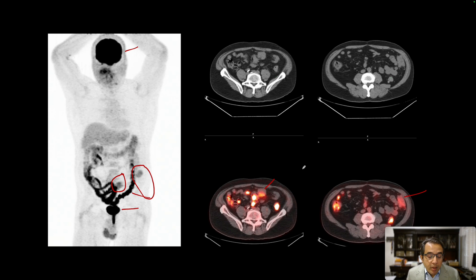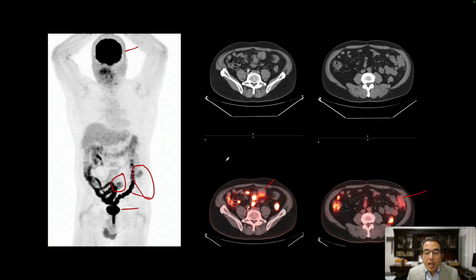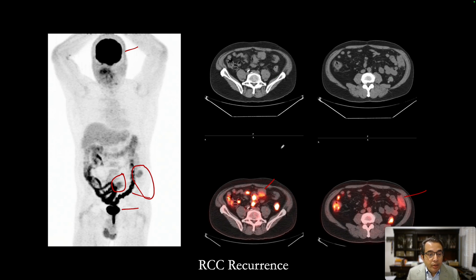FDG PET is very good for evaluating recurrence in renal cell carcinoma. The intensity of FDG uptake is not great, which is one reason FDG PET-CT is not ideal for primary diagnosis or staging of renal cell carcinoma — also because FDG is excreted from the kidneys into the urinary bladder. But once the primary has been removed, FDG PET-CT is very good for detecting recurrent and metastatic disease: soft tissue recurrence, lytic bone metastases, pancreatic metastases, and lung metastases.